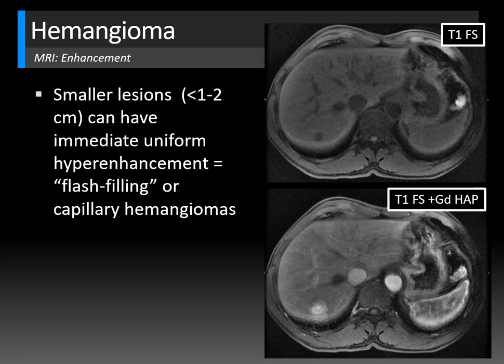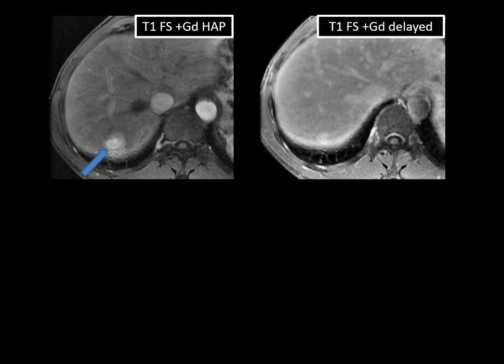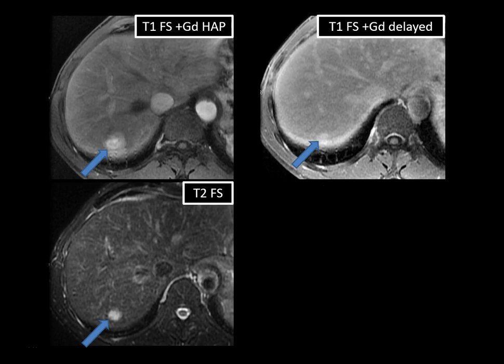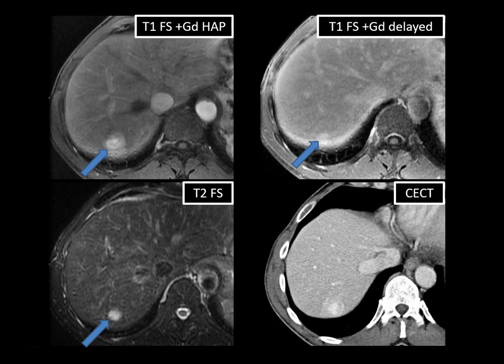The flash filling or capillary hemangioma pattern looks similar on MRI. A T1 fat-suppressed image shows the T1 hypointense hemangioma immediately filling diffusely on the hepatic arterial phase — the aorta is very bright, the spleen shows arciform enhancement, and the hepatic veins are not yet enhancing, confirming arterial phase. On the delayed phase, the lesion still shows persistent enhancement typical for hemangioma and is T2 bright relative to the spleen. The correlative CT scan confirms homogeneous enhancement.